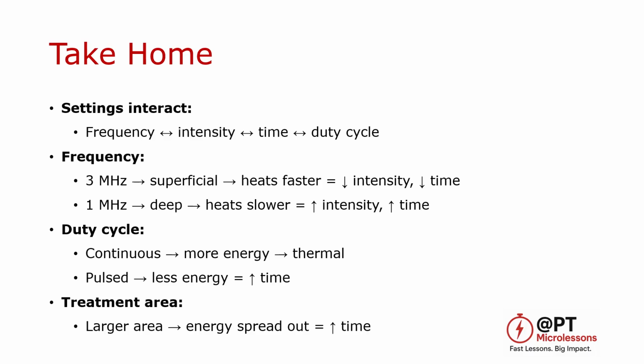Continuous ultrasound delivers more energy and produces thermal effects, whereas pulsed ultrasound delivers less energy, so treatment time is often increased to compensate. Finally, the size of the treatment area matters. As the area increases, the energy is spread out over a larger region, so more time is required. Overall, when energy delivery is reduced, whether due to depth, intensity, duty cycle, or area, treatment time needs to increase.